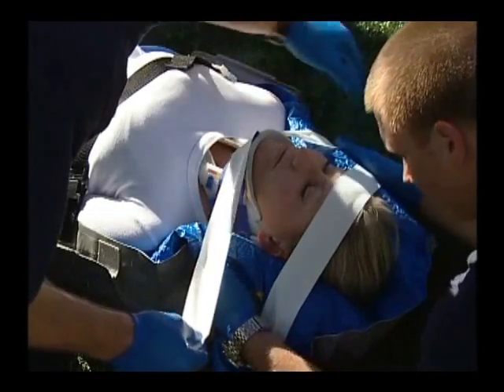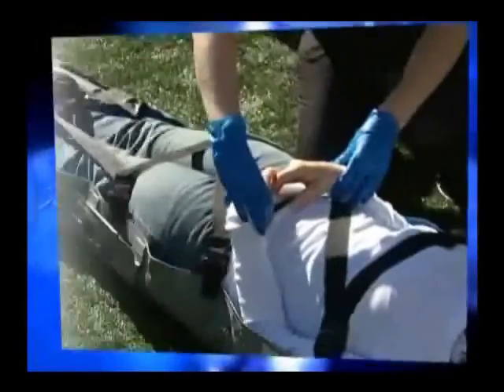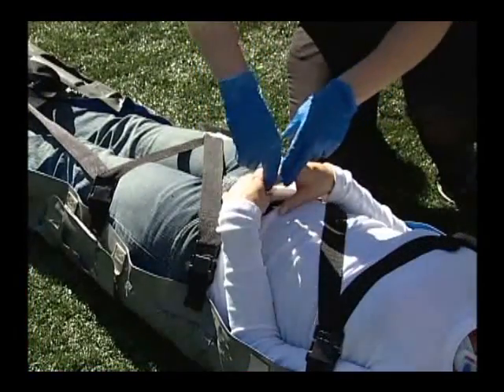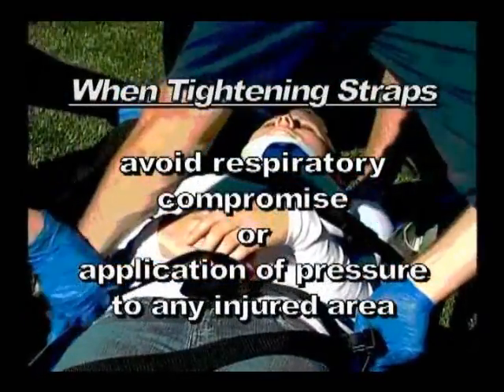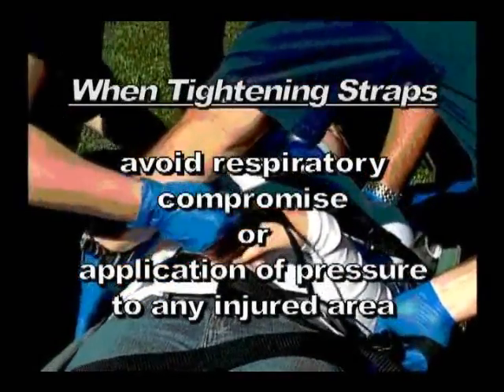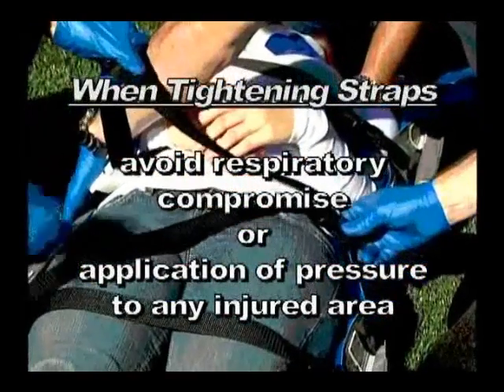Finish securing the patient's head using medical-grade adhesive tape. Snug up the patient restraint strap and check the patient's neurovascular status before moving. Always use caution when tightening the patient restraint strap to avoid respiratory compromise or application of pressure to any injured area.